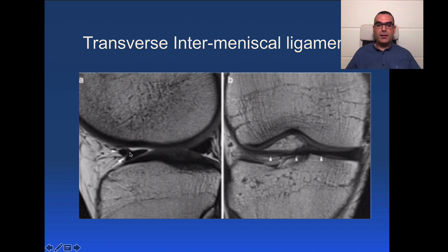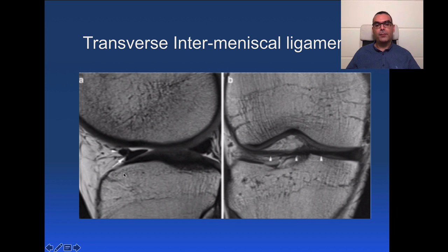Next is the transverse intermeniscal ligament, a transverse ligament coursing between the anterior horn of the medial and the lateral meniscus. It is a transverse horizontal fiber band connecting both anterior horns, and it can be seen at parasagittal cuts within the central aspect of the joint. It can be mistaken for a meniscal tear. This is a prominent transverse intermeniscal ligament.